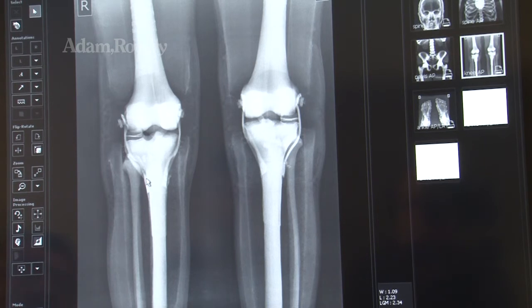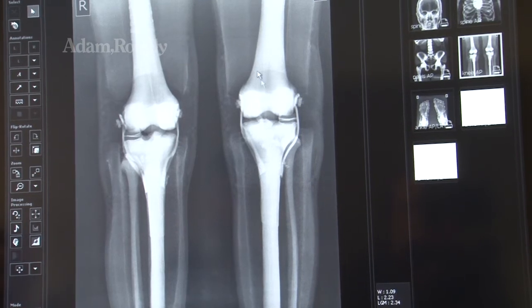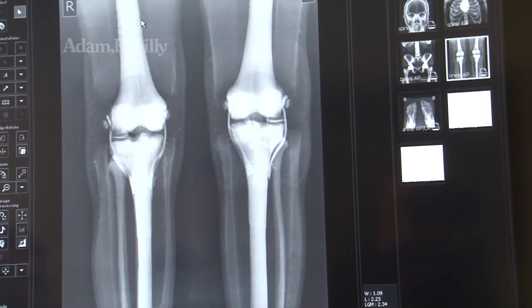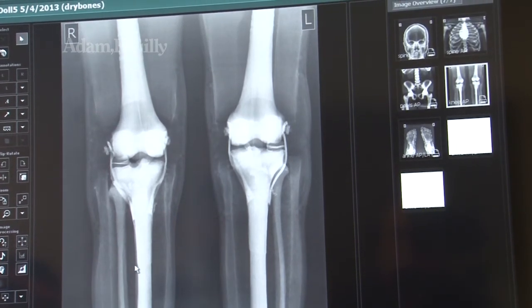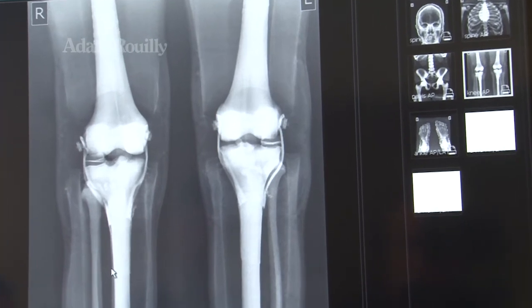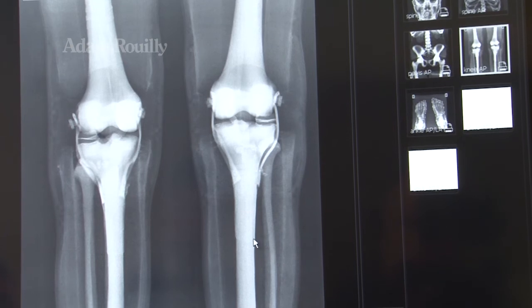And here we have the bone, the tibia, the femur and the fibula, with obviously the darker areas here being where there's no bone, where the radiation has gone through, and where it's whiter, that's where the bone is thicker. So we're getting effectively a shadow image of the X-ray beam passing through it. And this is very good here. They look symmetrical, they look equal. For example, the gap here between the tibia and the fibula is the same each side.